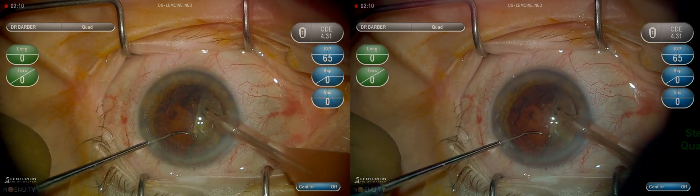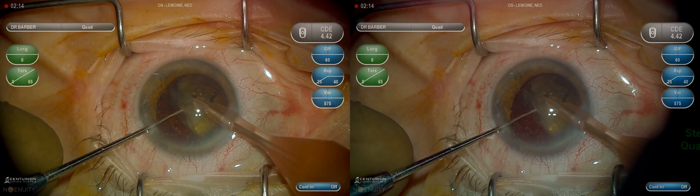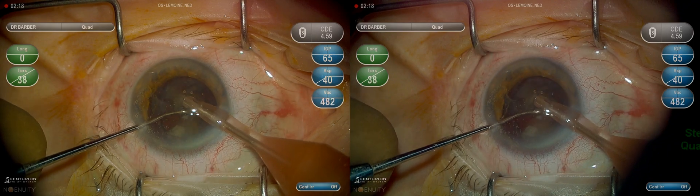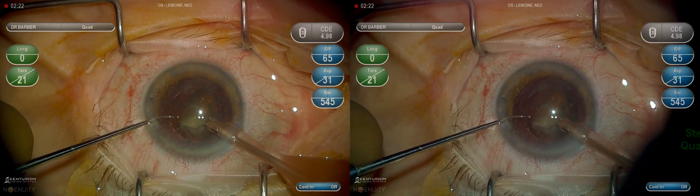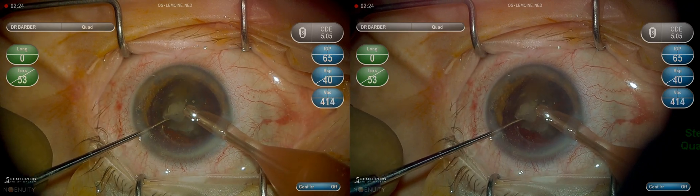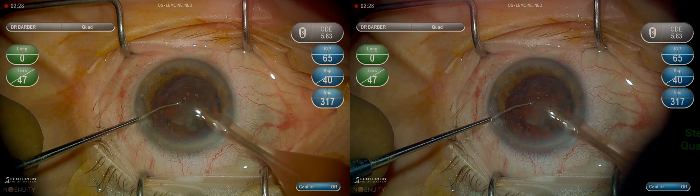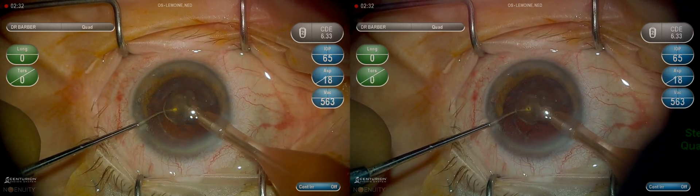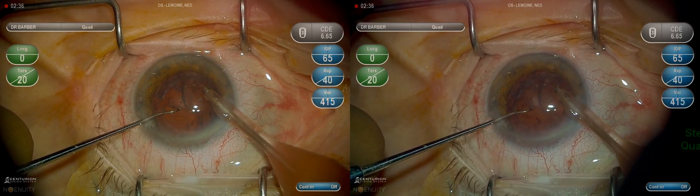We'll then use the second instrument to rotate the nucleus and again chopping from behind or posterior to the lens. At this point we have removed the majority of the lens, so we'll begin to use the second instrument beneath the lens material to provide protection for the posterior capsule, attempting to keep the second instrument posterior to the phaco needle, offering additional protection.